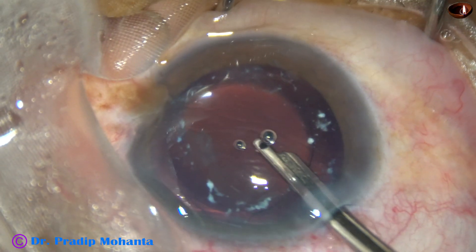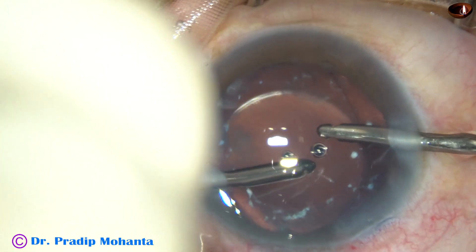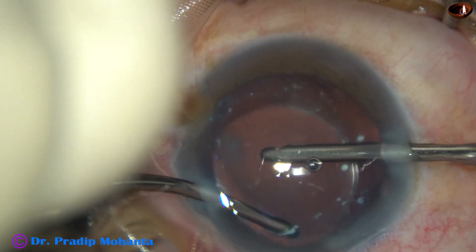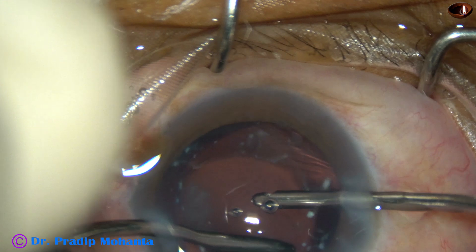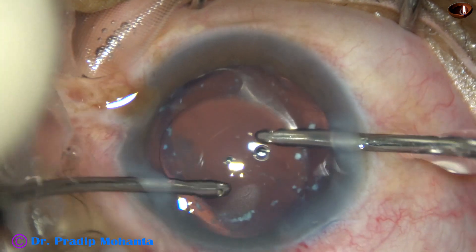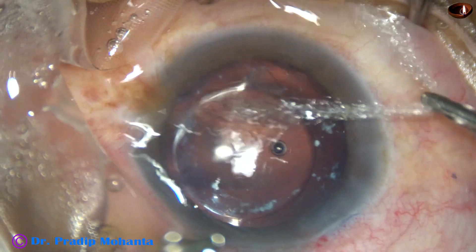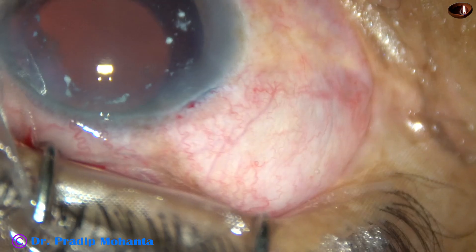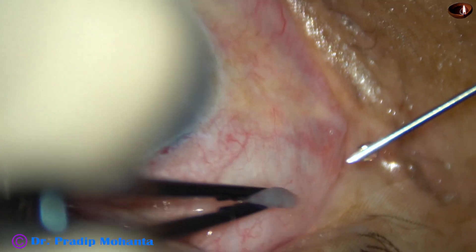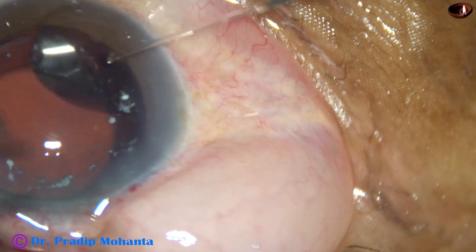This patient did very well — we are going to see some post-op pictures. Viscoelastic was nicely removed with the help of bimanual IA, and at this time I could find some lens fibers in the sub-incisional area. The side ports are hydrated and the anterior chamber is nicely formed. This is dexamethasone in the anterior sub-Tenon's space. I hope this will keep the anterior chamber quiet.